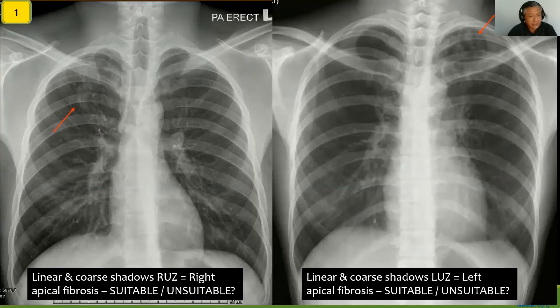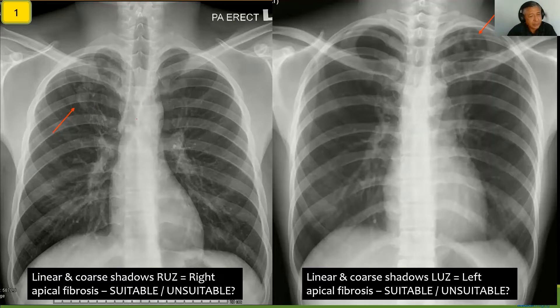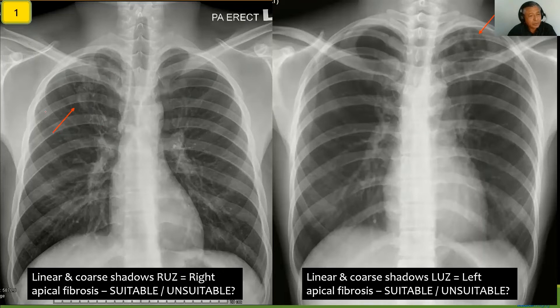Compare the one on the right. There are apical lobe vessels, but at the same time there are also other linear shadows, and some are coarse — so these are fibrosis. If you have difficulty making the comparison, just mentally block off the middle part and compare the portion of the lung film on the right versus the left. You'll agree there are a lot more shadows in the right upper zone. So this is right apical fibrosis, and definitely this will not be suitable.